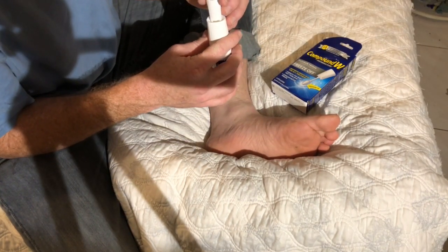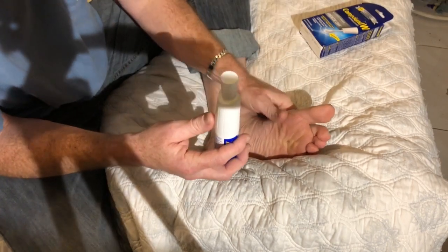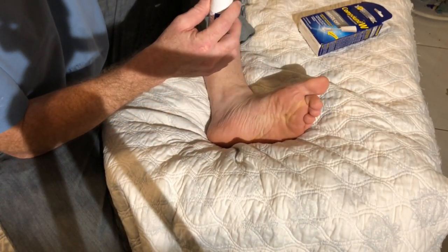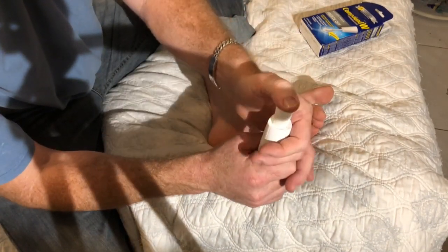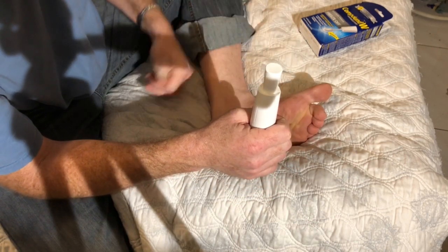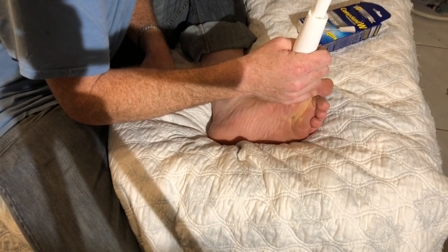I do want to do a follow-up video when it's done, but let's do this video first. Here we go — the wart is over there. Let's line this up. Hold it upright, don't hold it near your face.